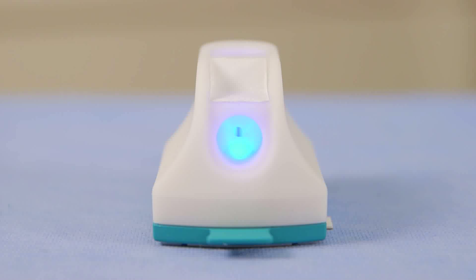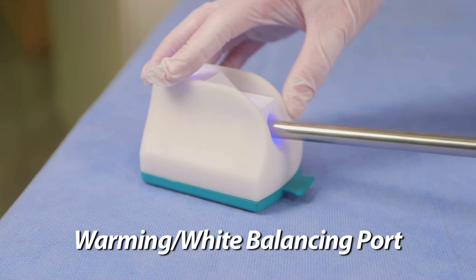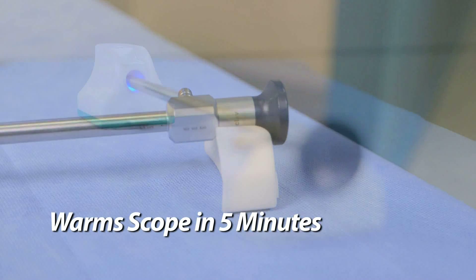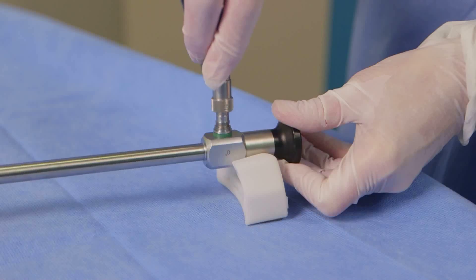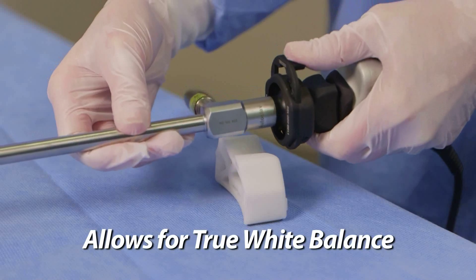Once the unit has been activated, the scope can be immediately inserted into the warming and white balancing port, located on the front of the unit. The scope can be warm and ready for use in five minutes. To white balance, simply connect the scope to the camera and light source while warming.